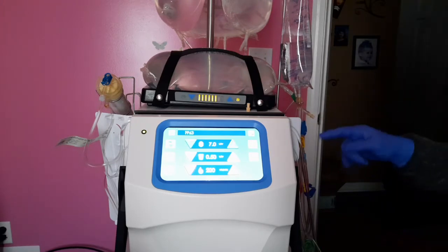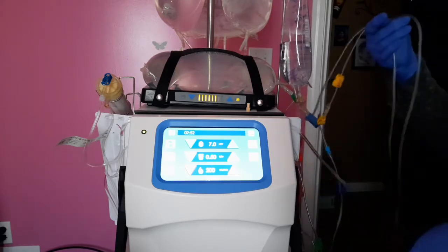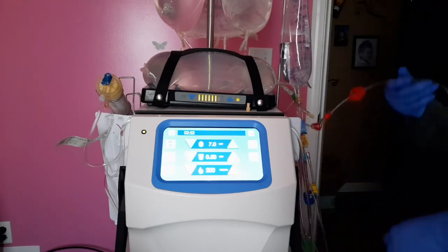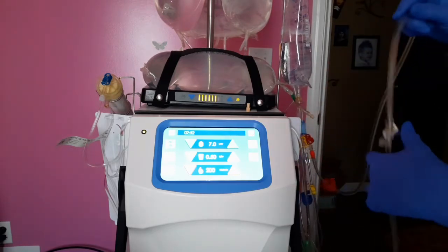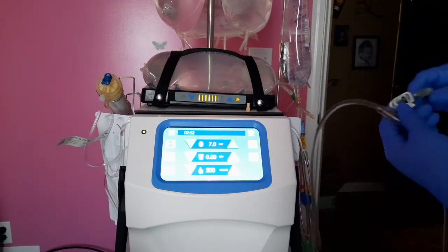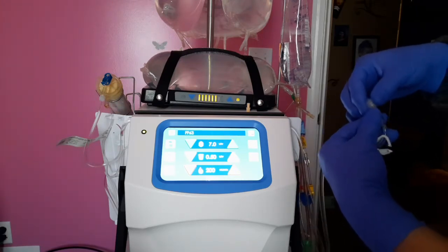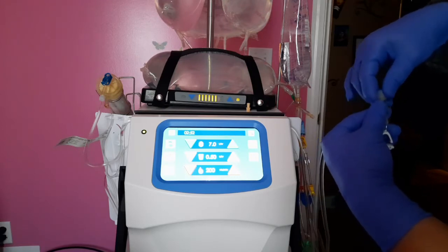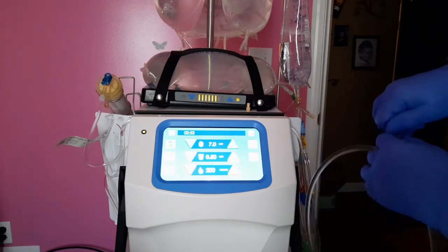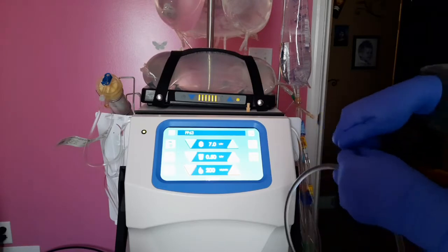All right, so now that I've hit the stop button, I am going to prime my saline T. And that is on the arterial line. You can see it's a white clamp. That's your saline T clamp. We're going to prime that by opening this up and letting the air out. You'll see the fluid come up. A couple of drops come out, that's fine. Don't worry about it. Just dab it with a 2x2. Okay, and then we're going to clamp.